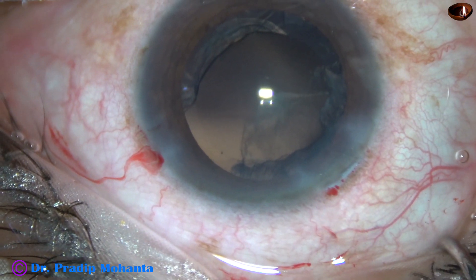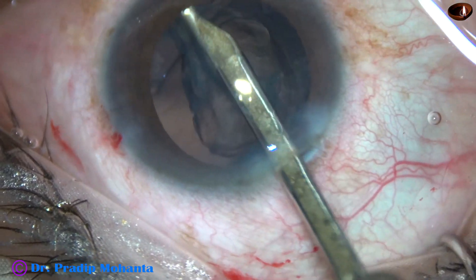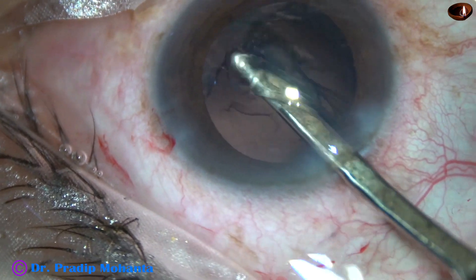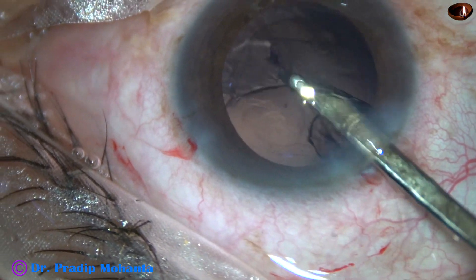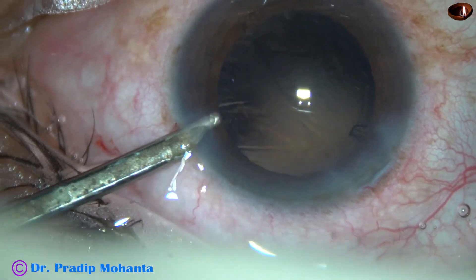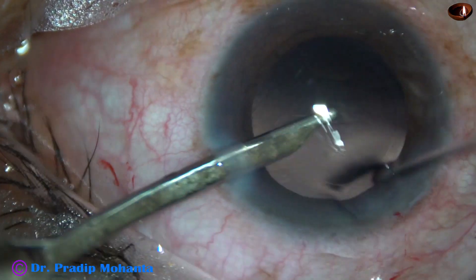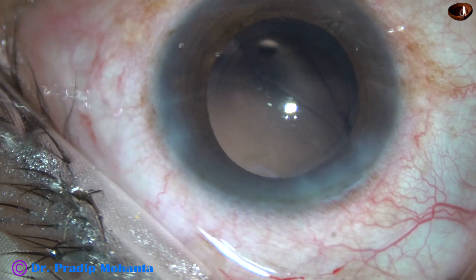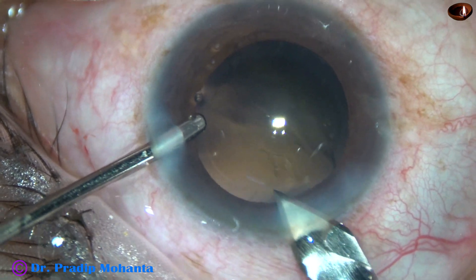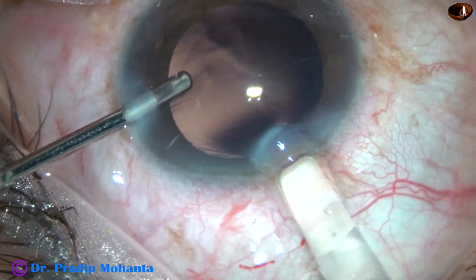Now I am going to use a 23G Simcoe cannula to remove cortex. Cortical cleanup can be done very easily with this. We have made only one side port, so we cannot use bimanual irrigation-aspiration. We can use hybrid aspiration. Now the wound is enlarged a little bit — the 2.8 mm wound becomes about 3 mm — and we can use a B-cartridge to implant the intraocular lens.